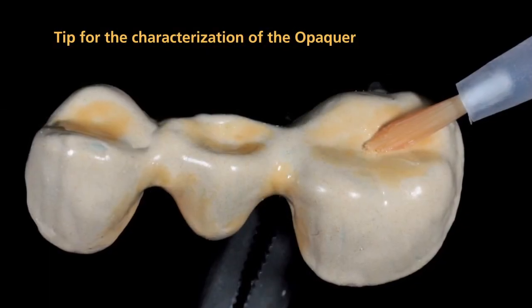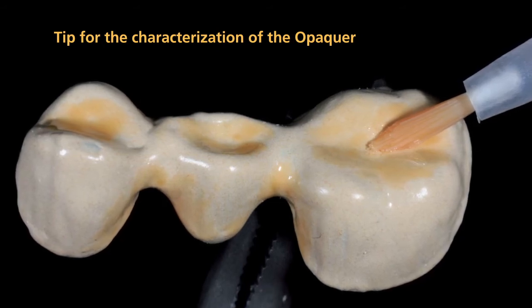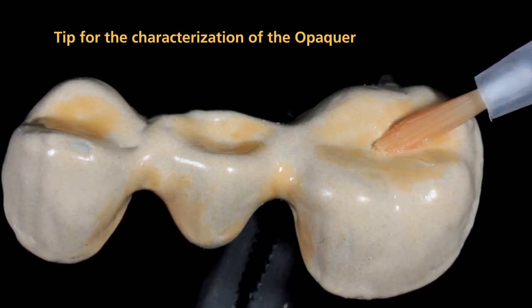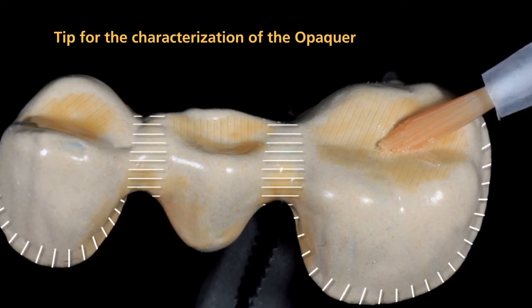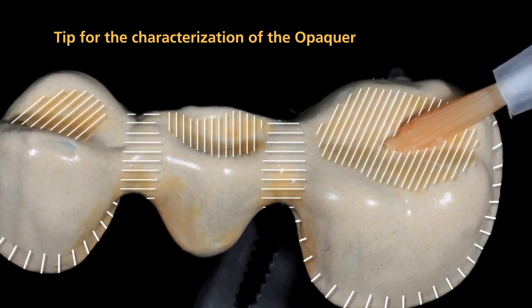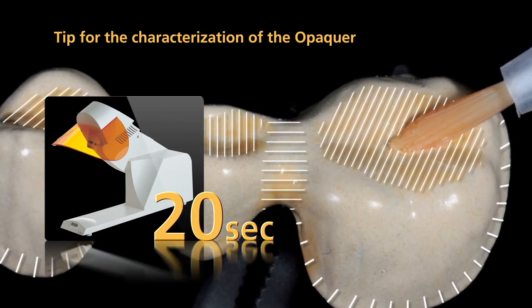After you have removed the inhibition layer, you may characterize or modify sections of the opaquer surface with SR-NEXCO stains. It is recommended that you apply a thin layer of stains to the marginal and interdental areas, particularly if space is limited, as this allows you to enhance the in-depth shade effect. After that, pre-cure SR-NEXCO stains for 20 seconds with the quick.